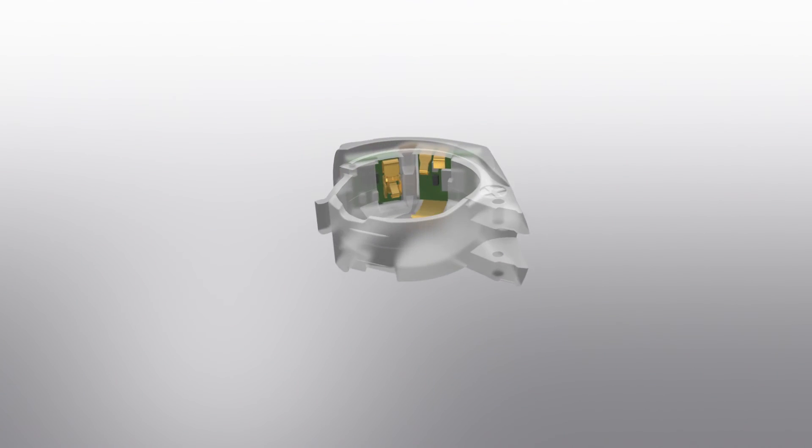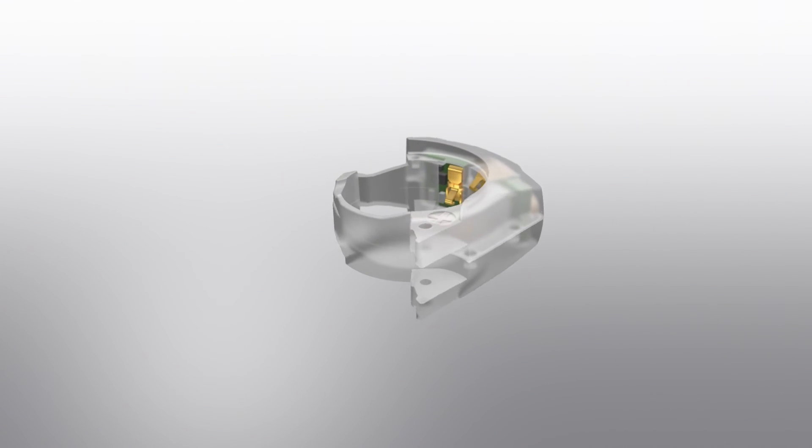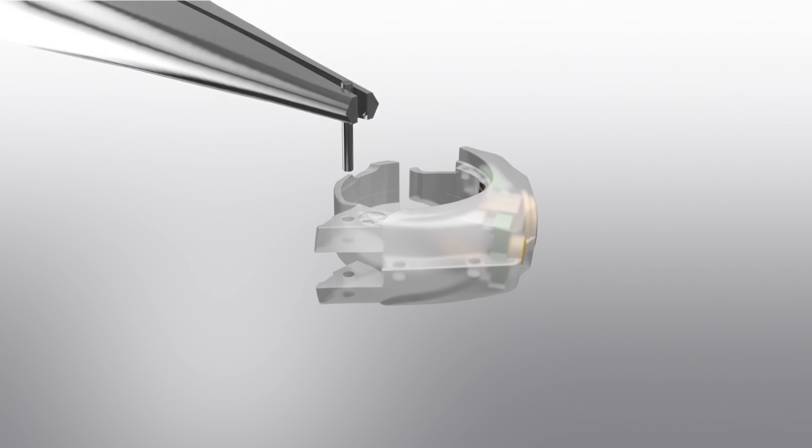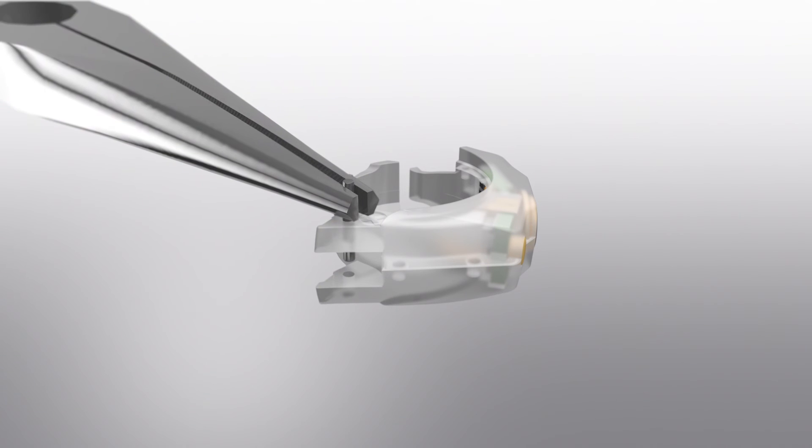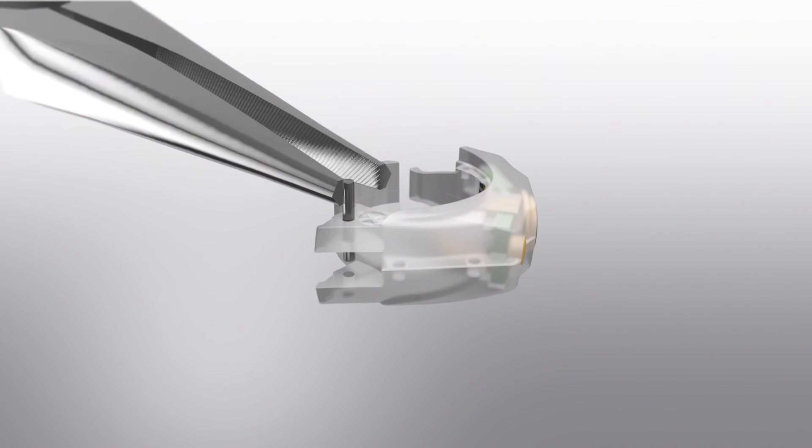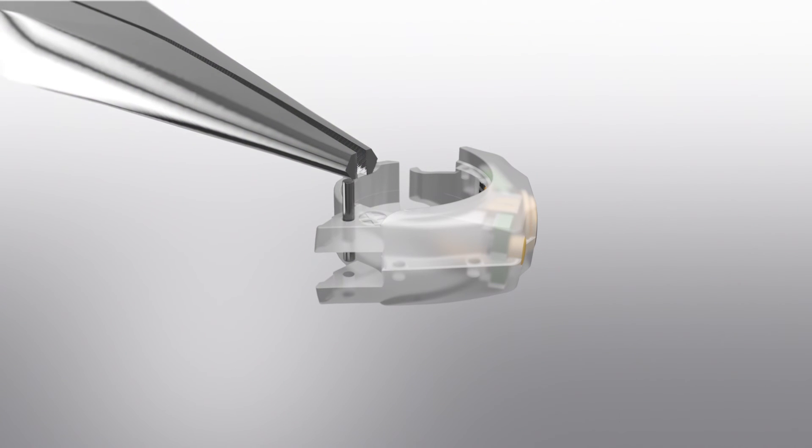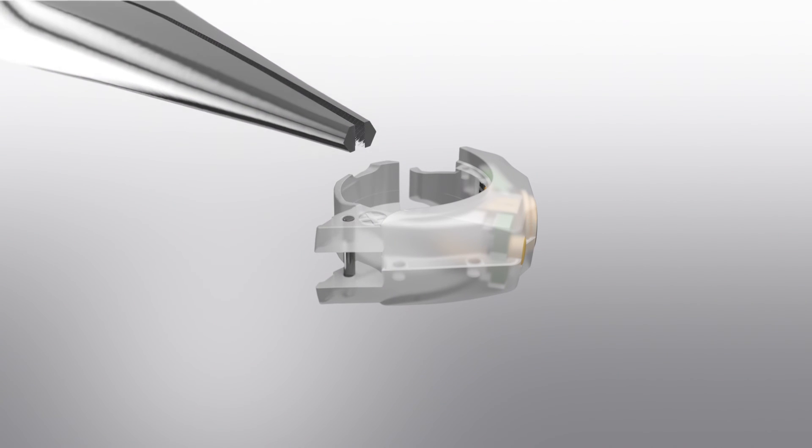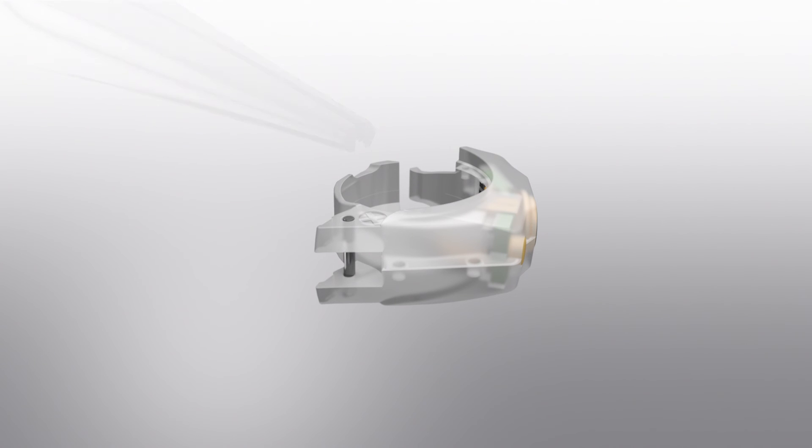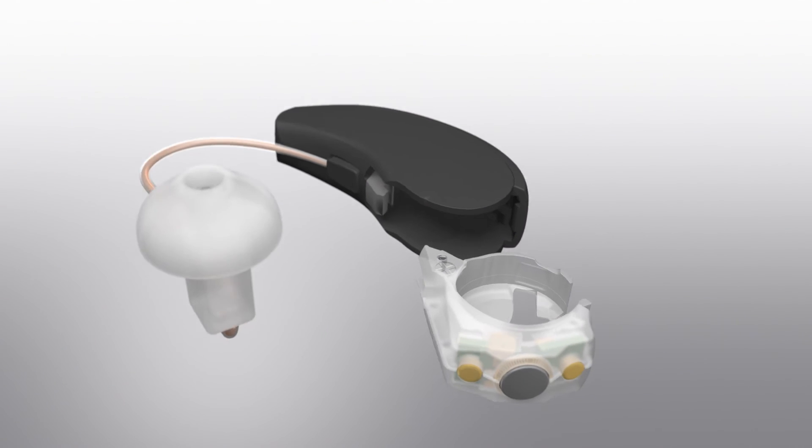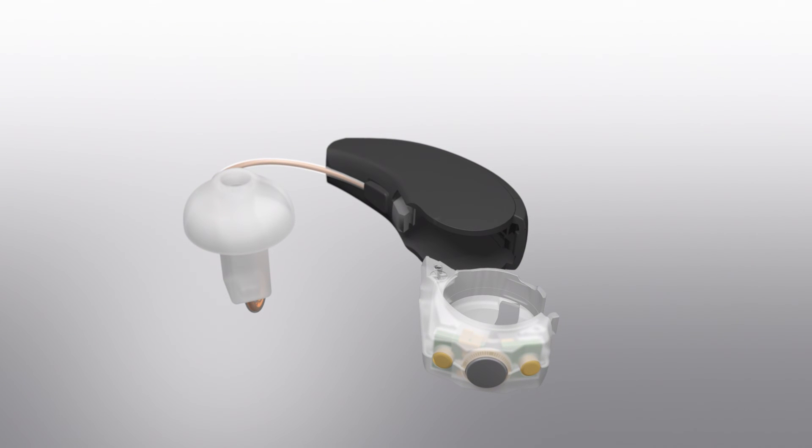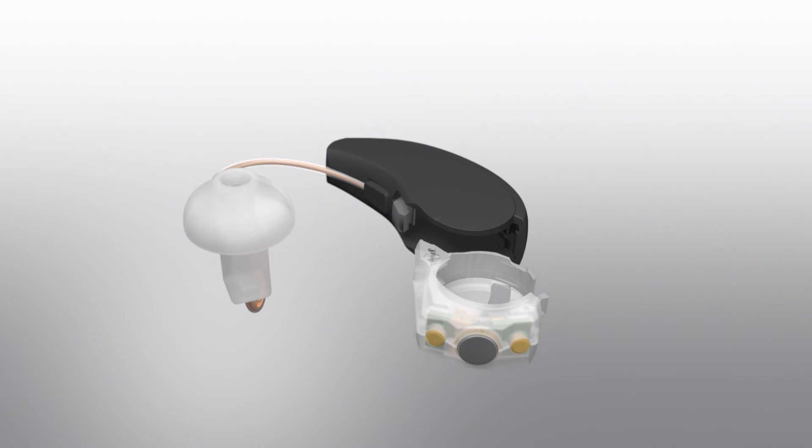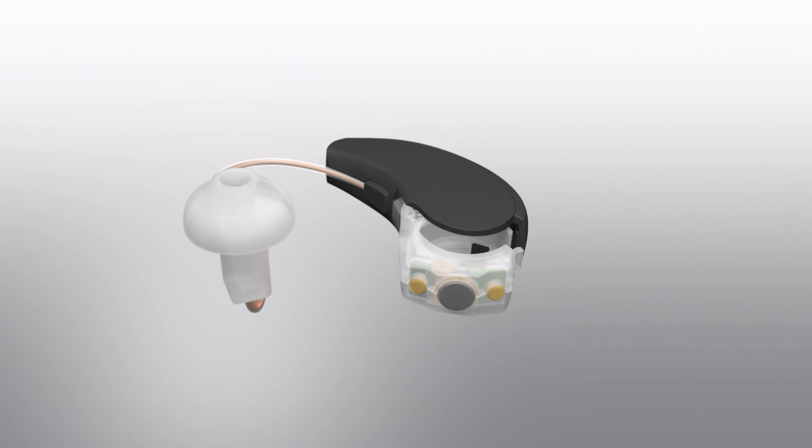Insert the battery pin into the battery hinge holes on the Z-Power battery module. Guide the battery pin into the hinge until you feel and hear a click.